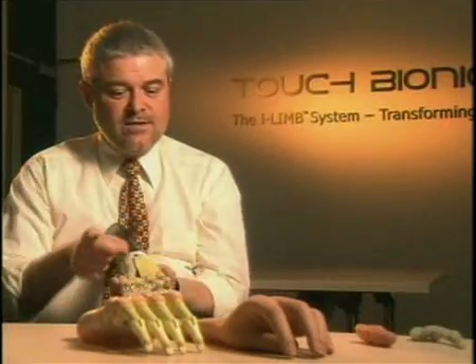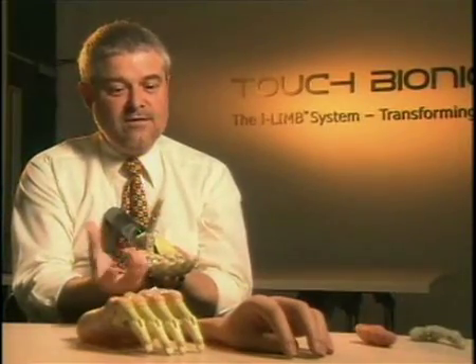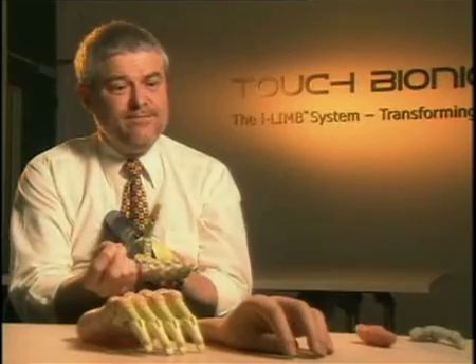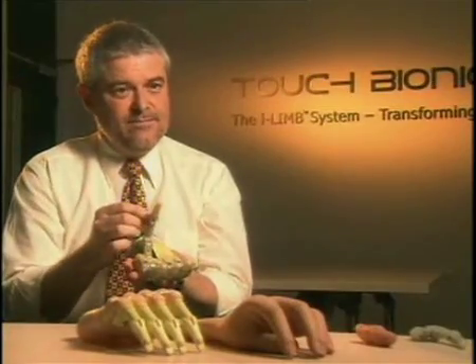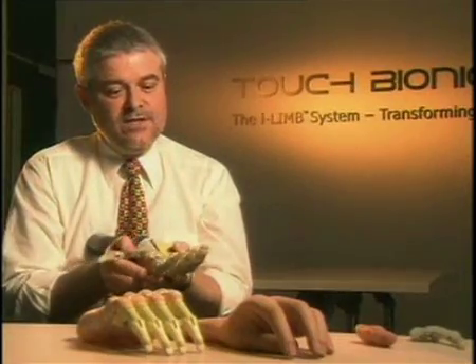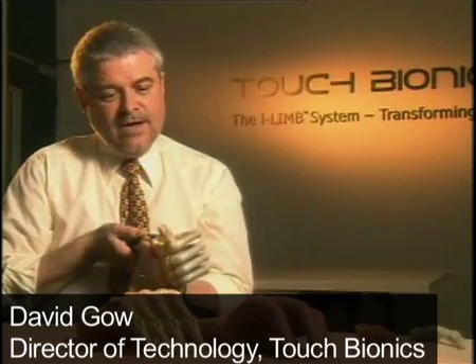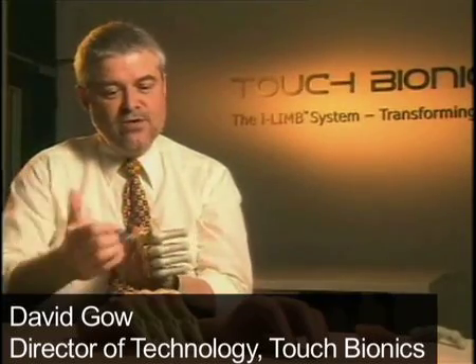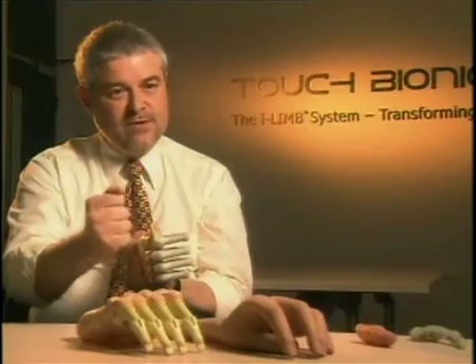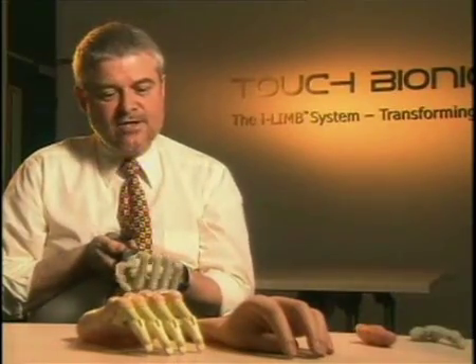Existing electric hands work like this: the thumb and fingers come together in one plane and you only get that pincer grip. We can mimic that with this hand, but we can also put it into different positions. That's the hand in a position you would use as a human to do what we call the power grip — for holding objects quite firmly — and you can't do that with existing electric hands.